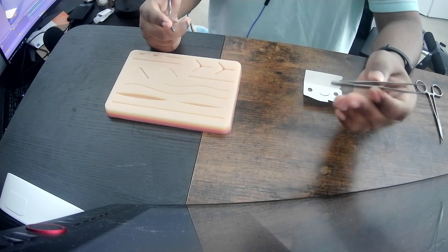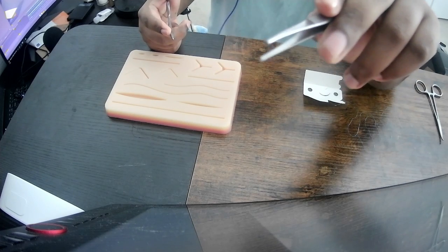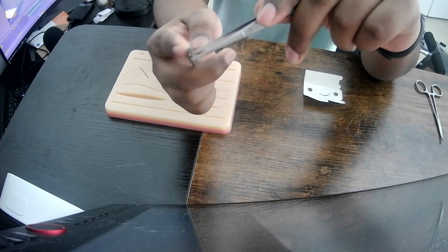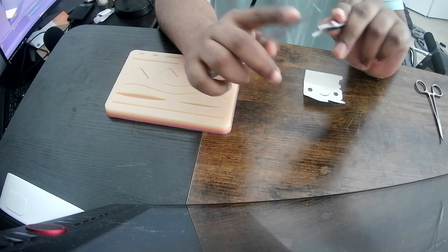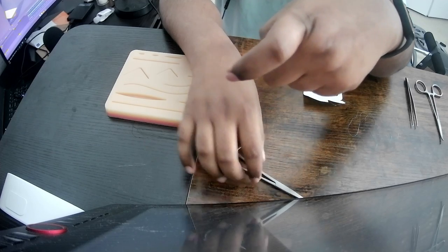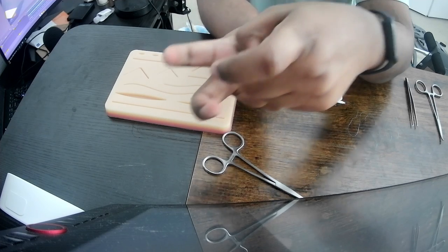Another tool, most common tool, is the Addison's forceps. I don't think my camera is good enough to pick up the details, but they're like notches on either end. One end has one, this one has two. It looks something like this. It's like one tooth here, and then two teeth on the bottom like this. And it locks in like that.